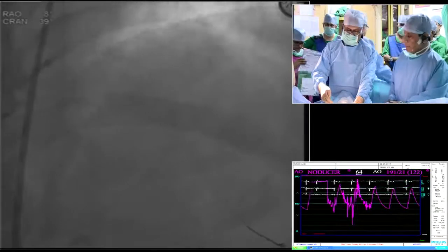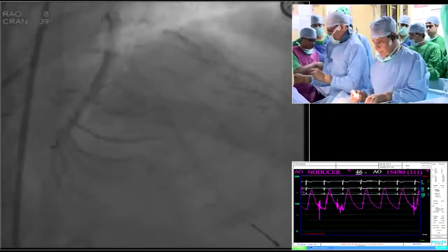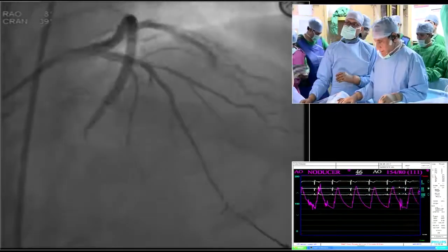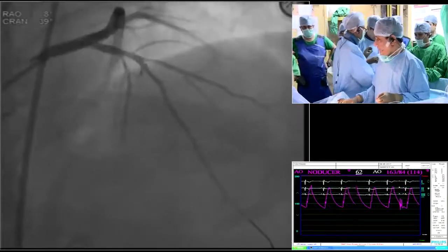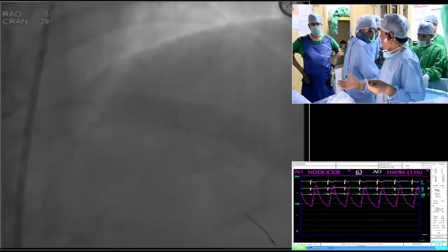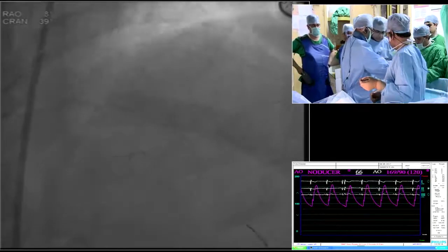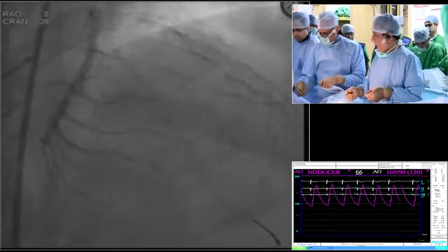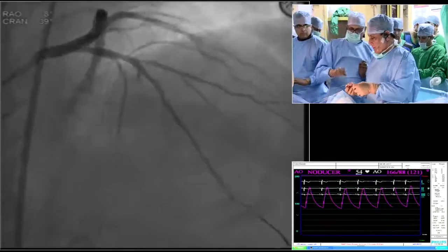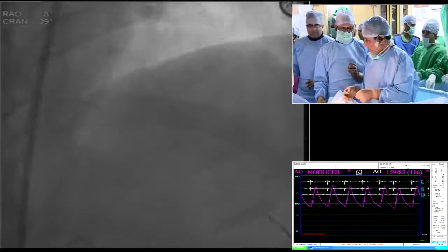Yeah. And as you saw, the data were presented of the MIRAS 100, 6 months data showing very little late loss, 0.15 millimeter, and no event at 6 months, although one case between 6 months to 1 year. Now data is reaching about 2 years. We actually deployed in the first 10 series a few cases right from here. And how has been your experience, Dr. Mahajan, on MIRAS, the cases which you've done? How many have come back, besides just the angiographic follow-up?